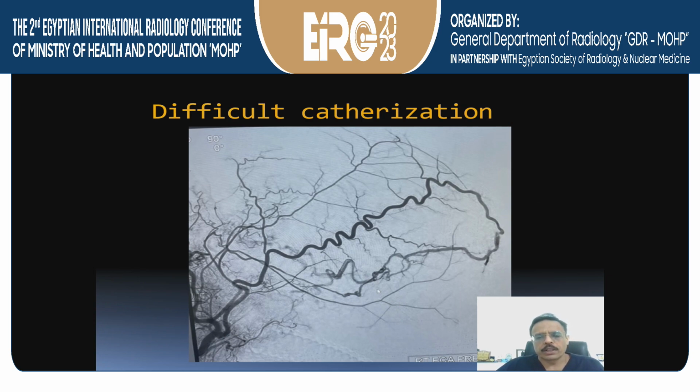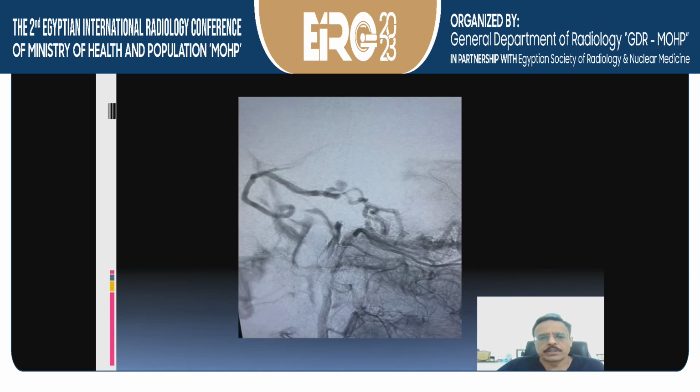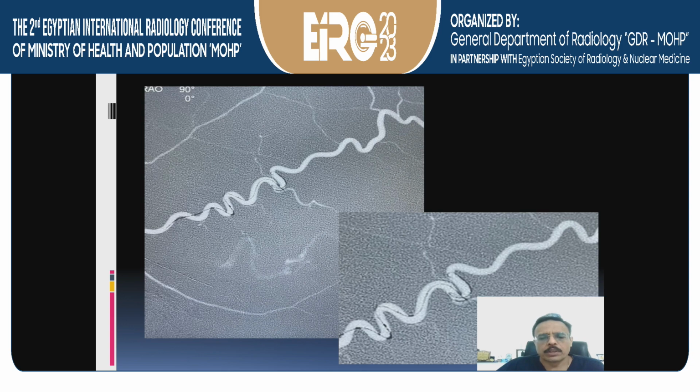This is again a dural AVF. One can see again it's deep-seated, but the feeder is a superficial artery with a very, very long course. Again, there are very minor vessels from the PCA as well. Now, even such a tortuous artery can be catheterized. As you can see in this roadmap view, we sometimes form a loop of the microwire, and over that we track a catheter like the Marathon. The loop of the wire helps in moving through all these kinks more quickly.